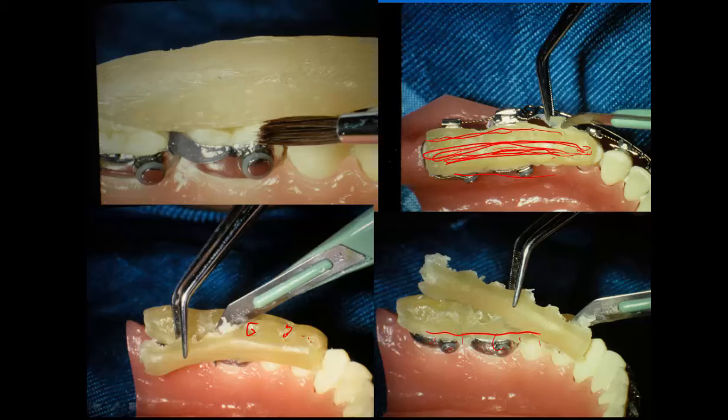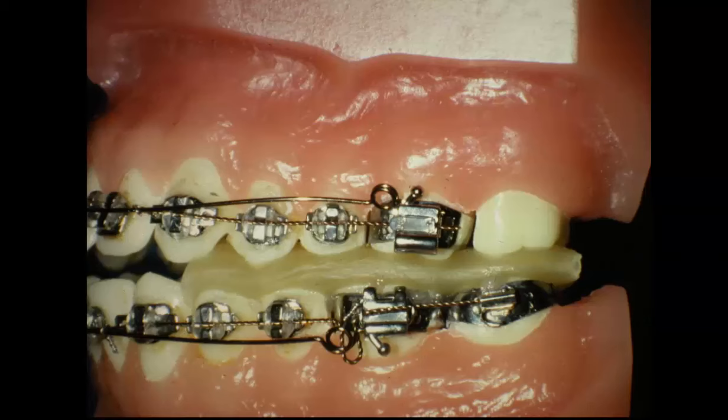And after you do that, you can have them actually close if you want to. Well, you should close down, and you'll have the indentations of the teeth in the acrylic. Now you come back and trim the excess in between there. Just trim it off with a burr. But first you're going to press it down like this and then light cure it. You come in here with your light and just cure this where it's pretty hard. And now we can open this up, and then you trim the little excess and just leave the points where the teeth touch here, then they can move around.